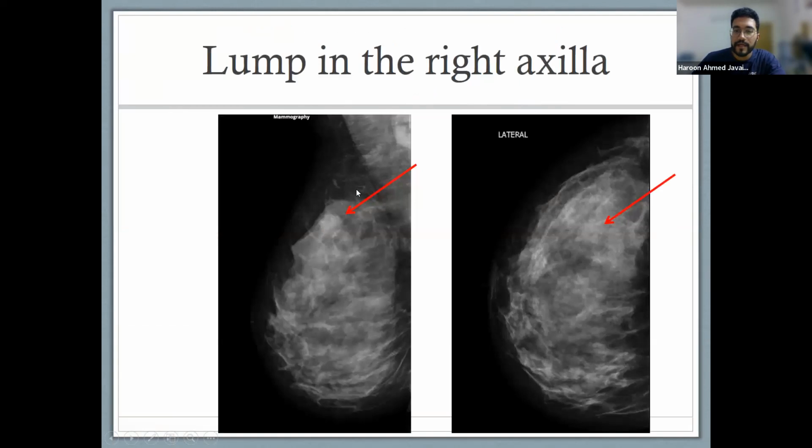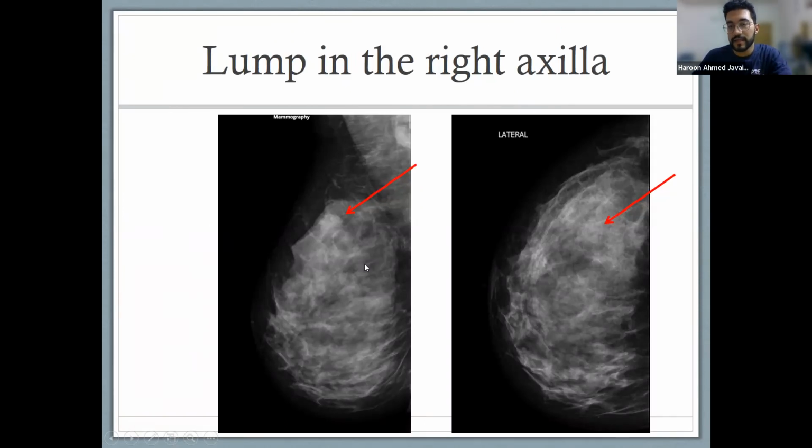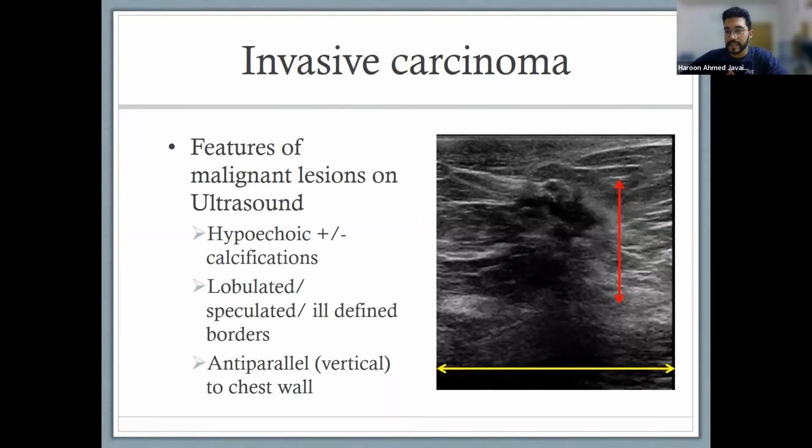Okay. So let's say we have an individual and they have this breast mass, this lump. They come in for a screening, and this is probably a young individual because you can see that there's a lot of density around it, right? So they do a mammography and they see that there is a lump. They find a lump over here, okay? So then what would be the next step? Since this is a young individual, and we said that you can't really tell much on a mammogram, they would move into the diagnostic phase, which is they want to know if this is cancer exactly or not. So in this phase, they would go for an ultrasound, okay?